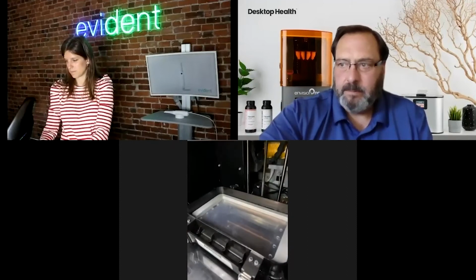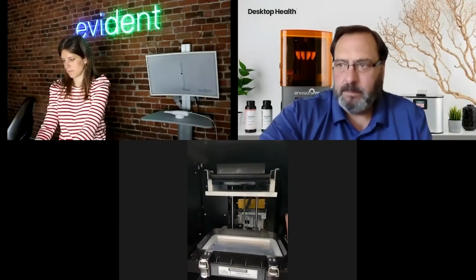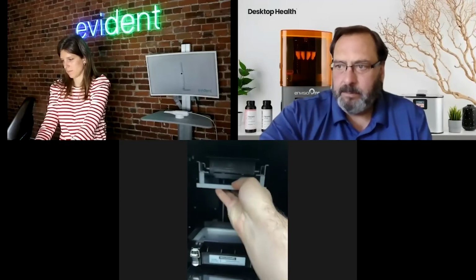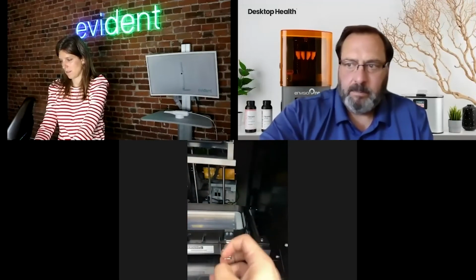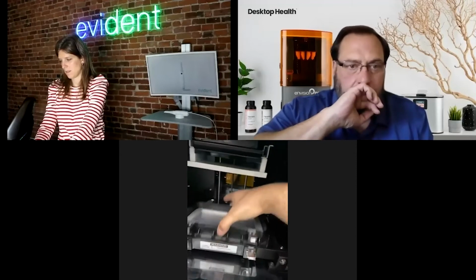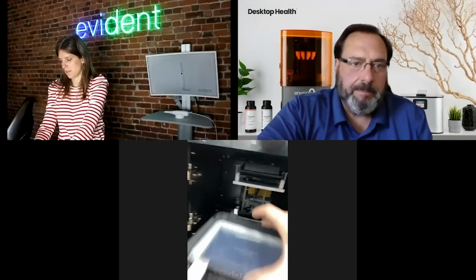Right now we have this one kind of nice and clean. Again, you can see the projector, you see the platform. To take the platform out, I can easily lift up this latch, slide out the platform, lock it back down. And then also I have the material tray, which sits on the inside here. The nice thing about these material trays, which is the consumable of the printer, is it's extremely easy to replace, and it's easy to run.